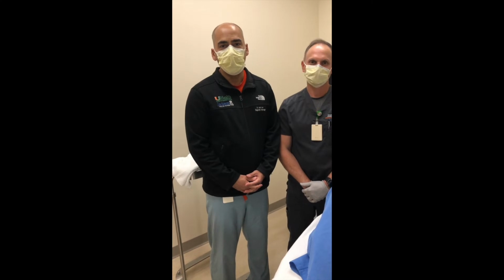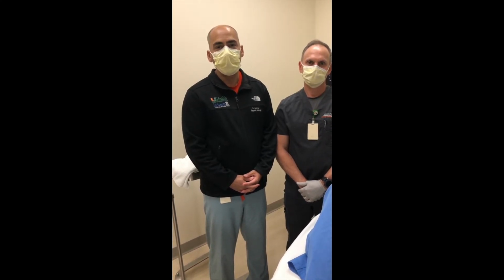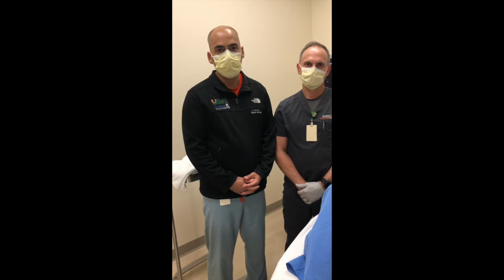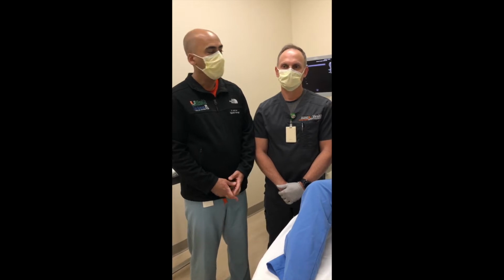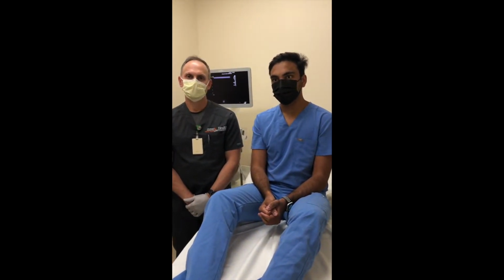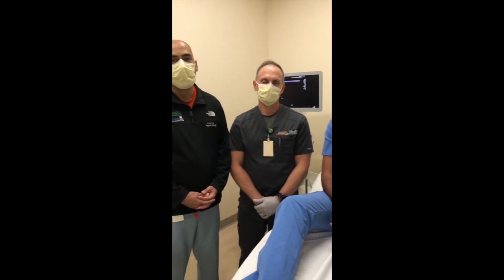I'm Dr. Jean Jose, Department of Radiology, University of Miami, Medical Director of the Lennar Foundation Medical Center. We're here to introduce you to the fundamentals of musculoskeletal ultrasound imaging. I'm joined by Louis Payro, Ultrasound Supervisor for the Lennar Foundation Medical Center, and Nikhil Patel, medical student of the University of Miami School of Medicine, that will serve as our patient.